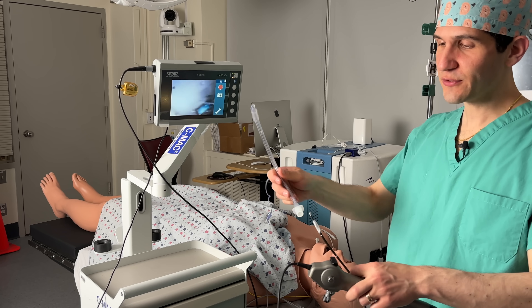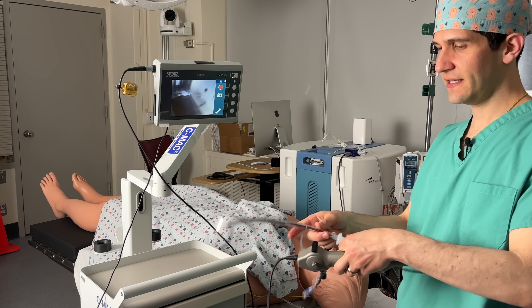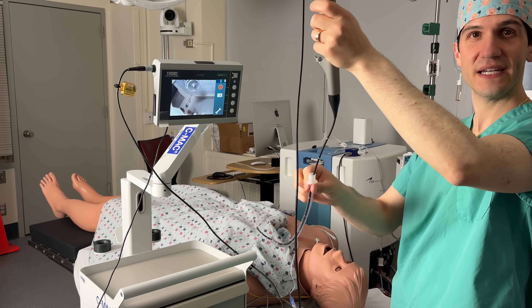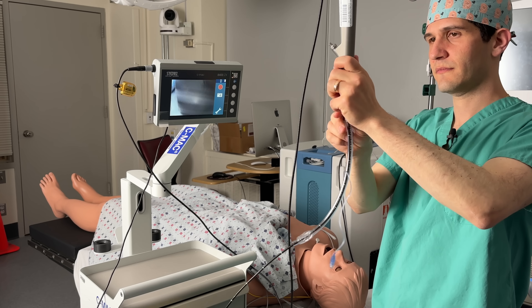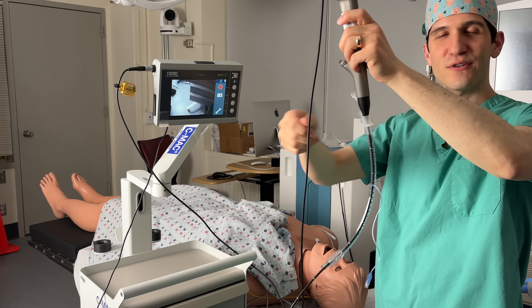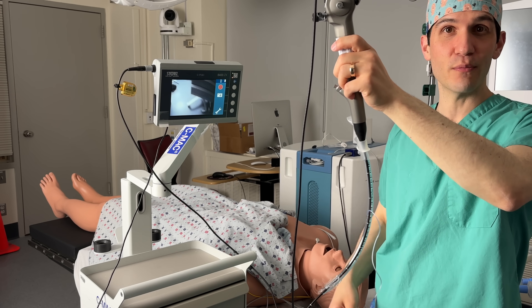Before you get started, you of course need to put an endotracheal tube on the scope itself, which is very easily done by sliding it in. It's most helpful to secure the tube up top so it doesn't slip down and get in your way as you're trying to intubate — I usually do that with a small piece of tape. Just make sure this tape is very easy to remove so that you don't get hung up trying to rip it off while the patient's still awake and you're trying to get the tube down the scope.